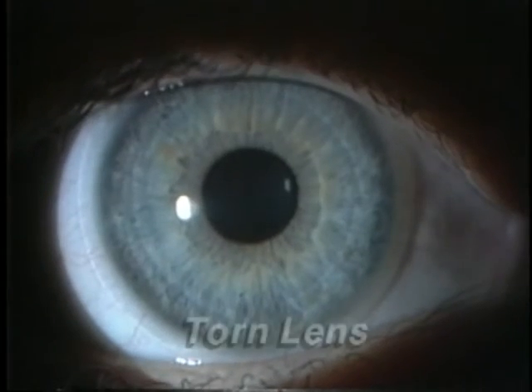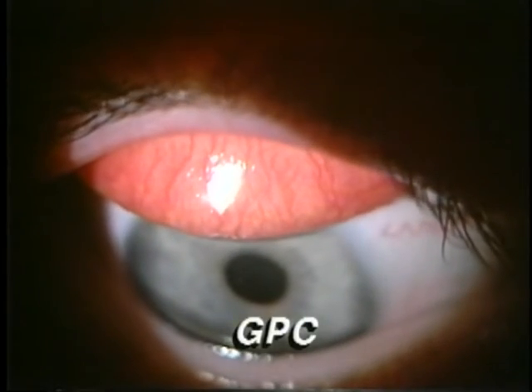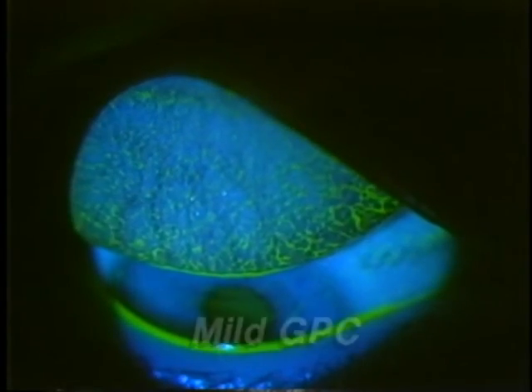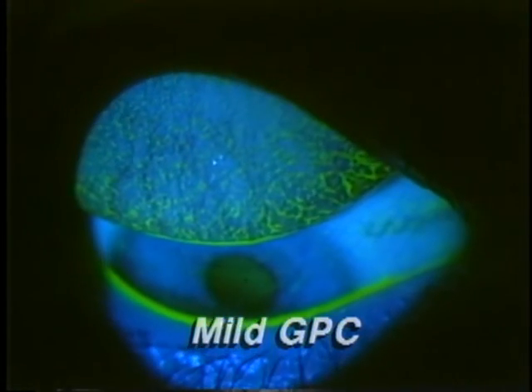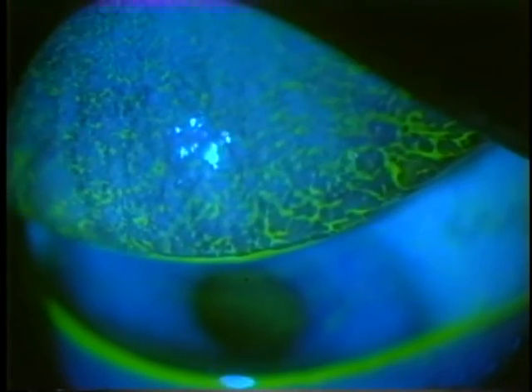Though diffuse illumination allows a paracentral soft lens tear to be observed, especially after the blink, retro-illuminations are more helpful for viewing this condition. The tear is clearly visible in indirect retro, and even more so using direct retro, where the light reflected off the iris illuminates the tear directly from behind. Note the lipid surface deposits observed in the area of the tear, seen in both direct focal and retro-illumination beam paths. Eversion of the upper and lower lids is an important procedure for determining if giant papillary conjunctivitis (GPC) is present. Diffuse illumination is commonly used for this evaluation, with papillary hypertrophy best outlined by fluorescein application. GPC is common to soft lens wearers, often resulting from a gradual reaction to lens surface deposits.